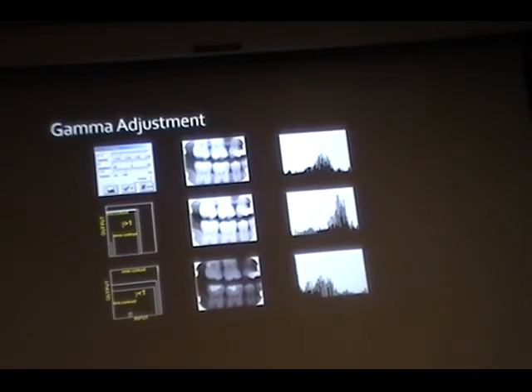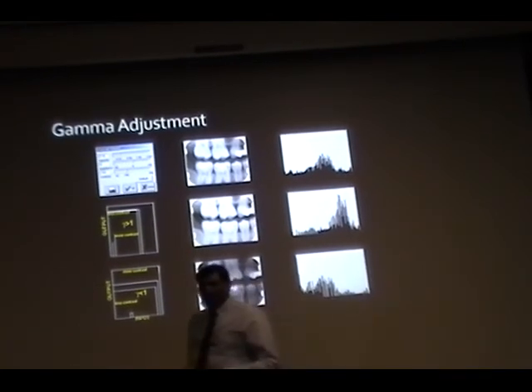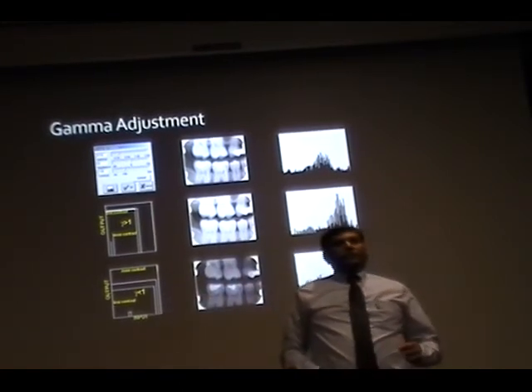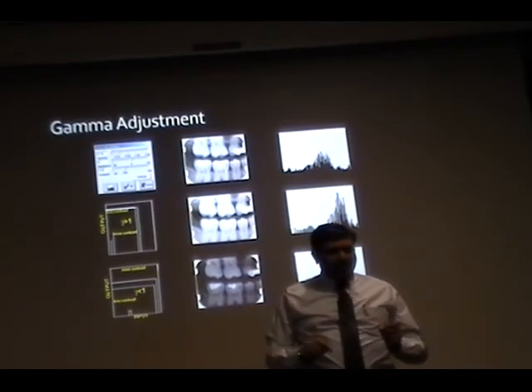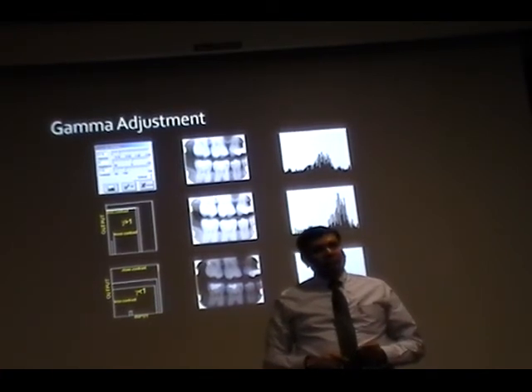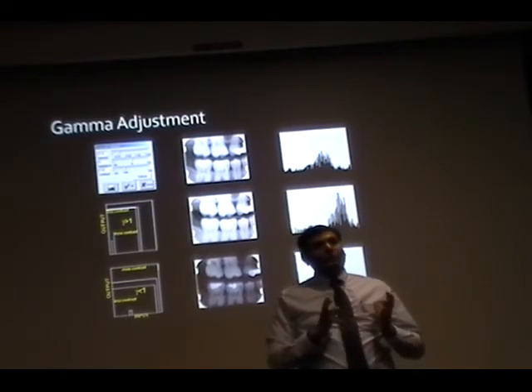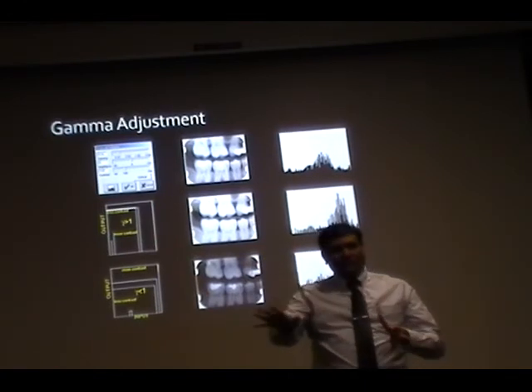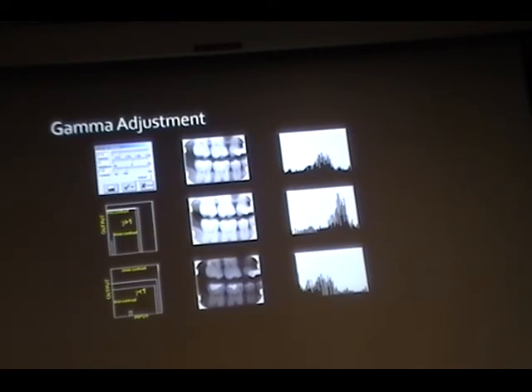To give you an example, if you look at the images, if you get a chance, before 2014, they never adjusted gamma. So they were struggling with how they can make images prettier. One of the major changes that I made after coming to this dental school is gamma adjustment. Now you can see our images are being showcased at different places, that we are getting beautiful images. Other than that, what I showed, picture of the day. No, there are some crappy images, of course. But overall, we have drastically improved with just changing gamma.